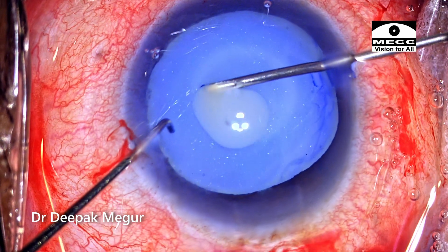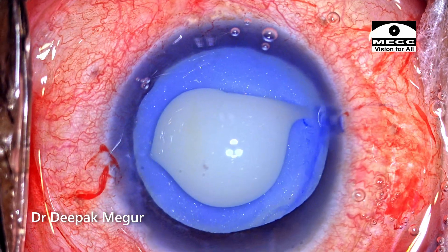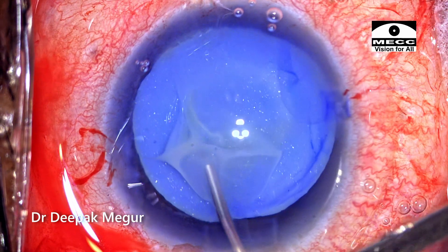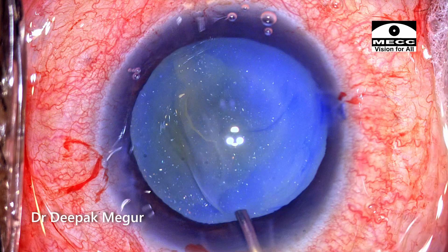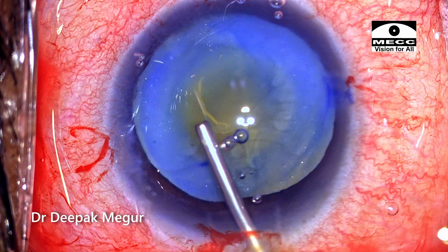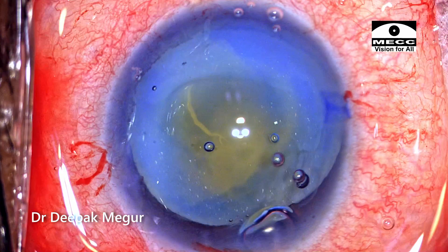Using a 26-gauge needle, the anterior capsule is punctured and as expected the fluid cortex gushes out. Gentle irrigation with BSS helps to wash out all the liquid cortex, which in turn helps to see clearly. Dispersive OVD is again replenished into the anterior chamber above the level of the anterior capsule flap.